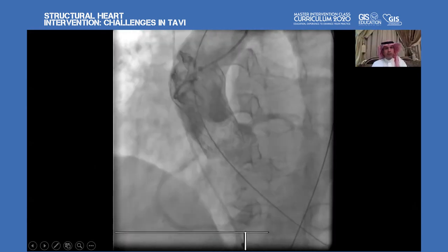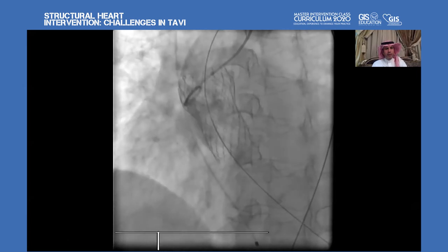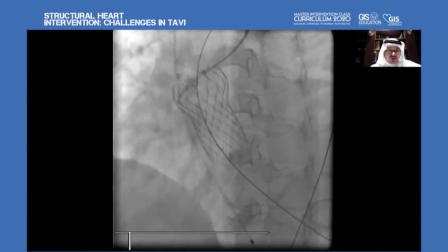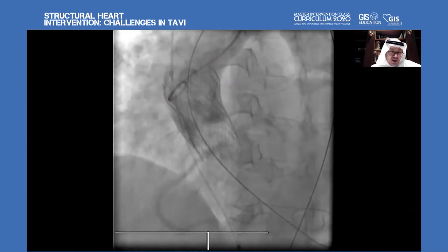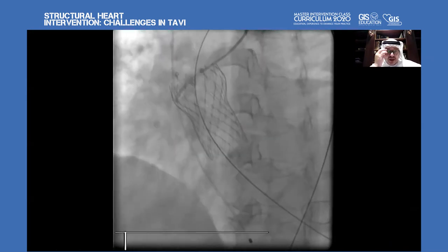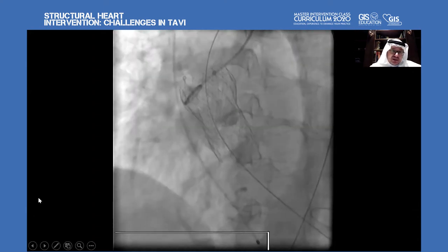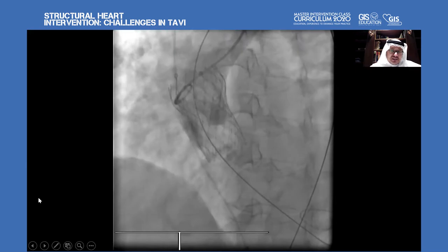Okay, great. Dr. Wael, do you do anything different? Well, just a couple of comments. I agree with Dr. Lafon. It was constrained. And in one of the images during the deployment, there was clearly parallax. Compare the one while you deploy and this, there is definitely parallax.